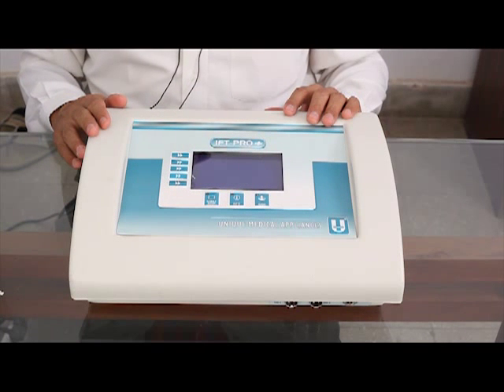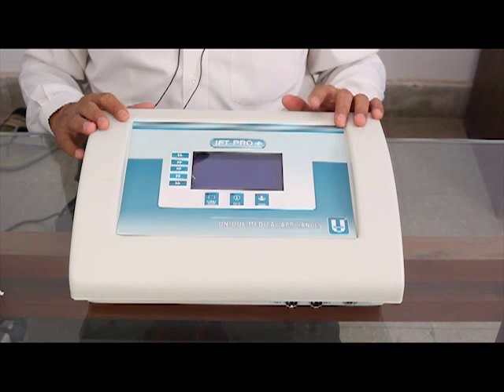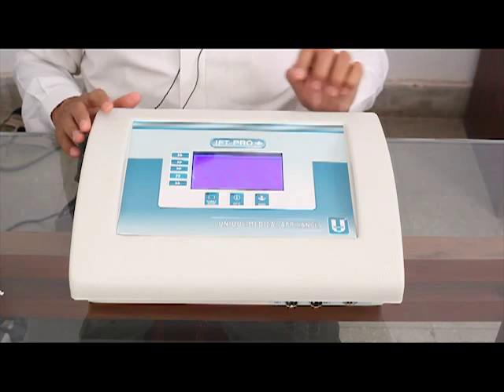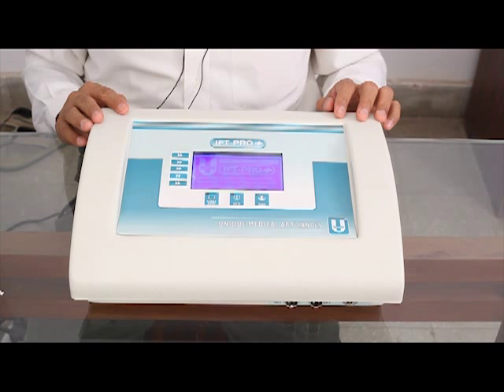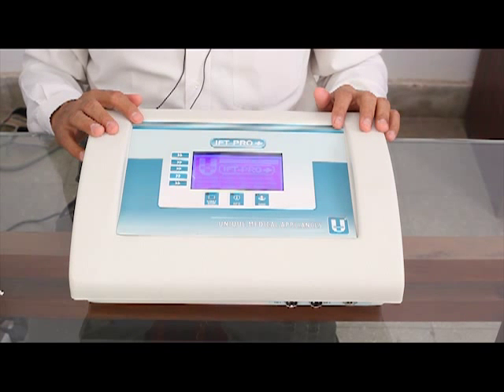This is the unit that we are talking about. I'll first introduce you to the different features, buttons, and switches on the unit. I'm going to switch it on from the power switch which is located at the back. The machine immediately spoke out the intro message: 'Unique Medical Appliances welcomes you. Accessibility features in this unit have been promoted by the Xavius Resource Center for the Visually Challenged, XRCVC Mumbai. Press any key to continue.'